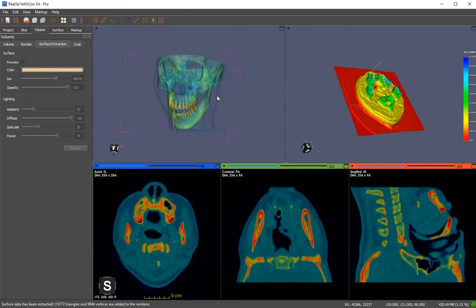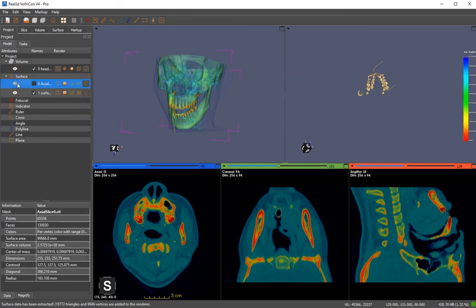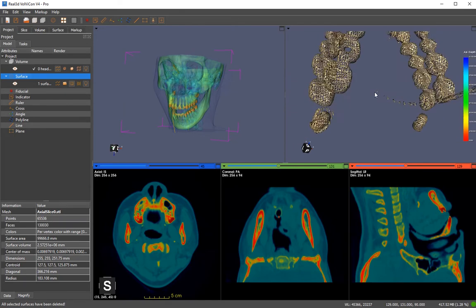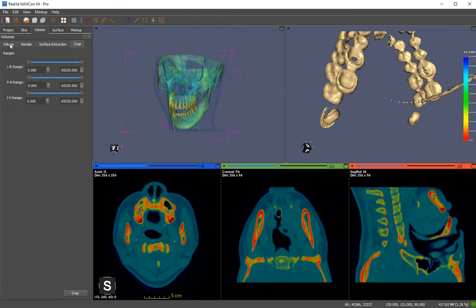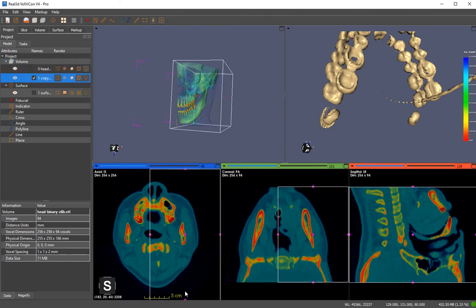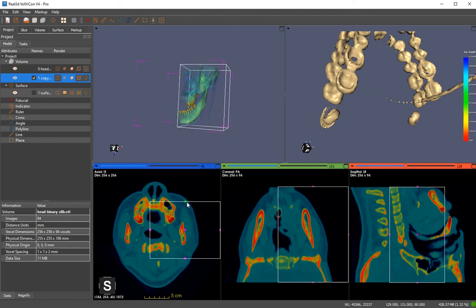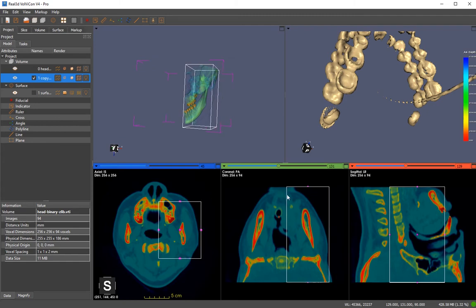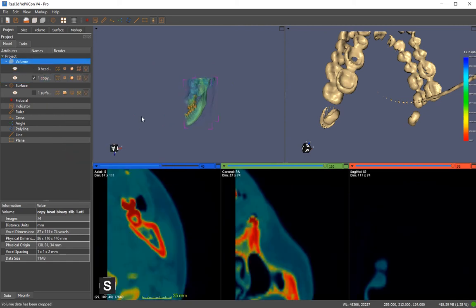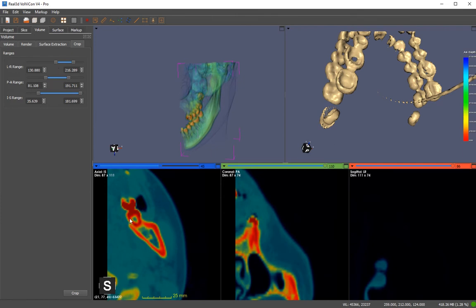You can reconstruct a surface model from the volumetric data using thresholding segmentation — you could call it extraction. Let me delete that. You can also crop this volumetric data: let me create a copy, turn on cropping, go to Tools and crop — the data is now cropped. You can interact with the crop in 3D and 2D views or using sliders.